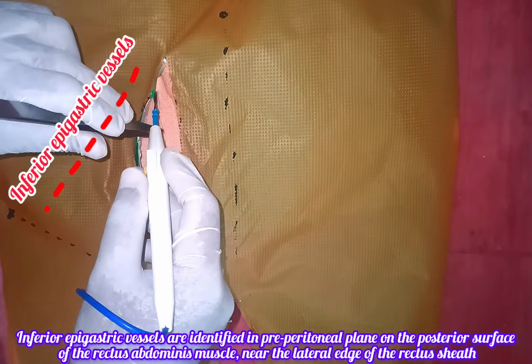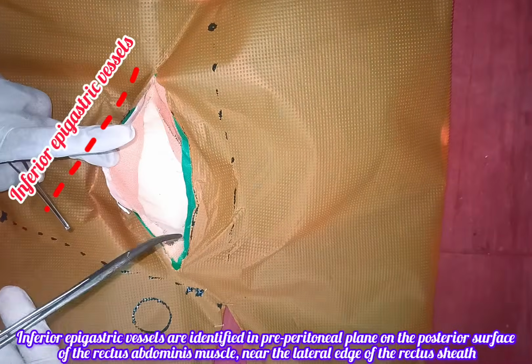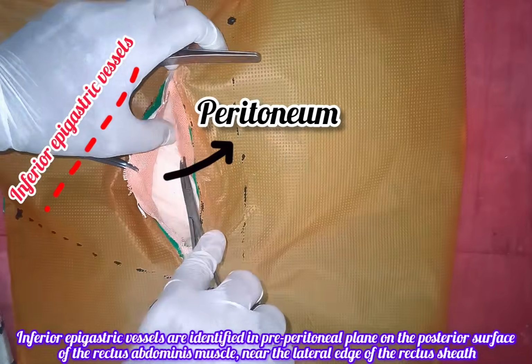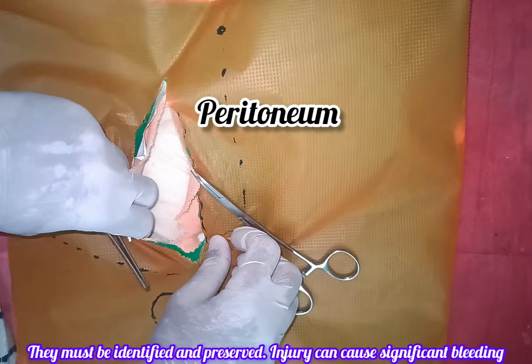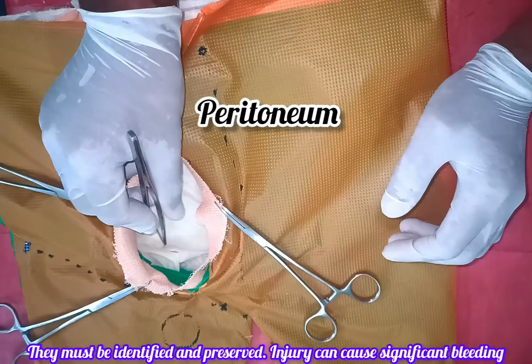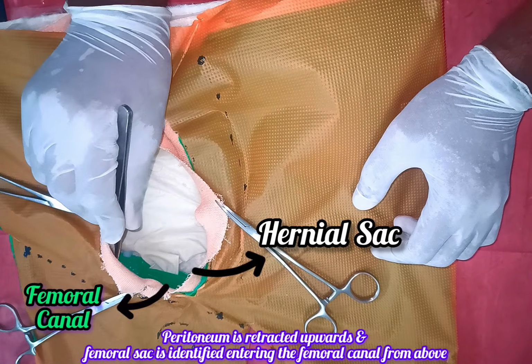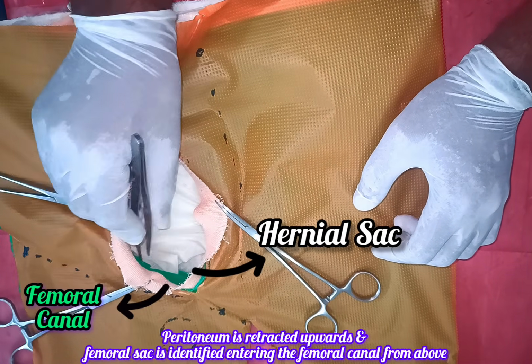Inferior epigastric vessels are identified in the preperitoneal plane on the posterior surface of the rectus muscle, near the lateral edge of the rectus sheath. They must be identified and preserved. Injury can cause significant bleeding. The peritoneum is retracted upwards and the hernial sac is identified entering the femoral canal from above.